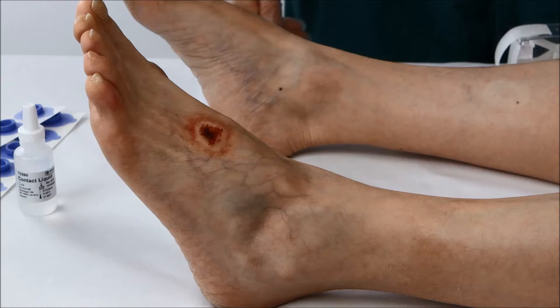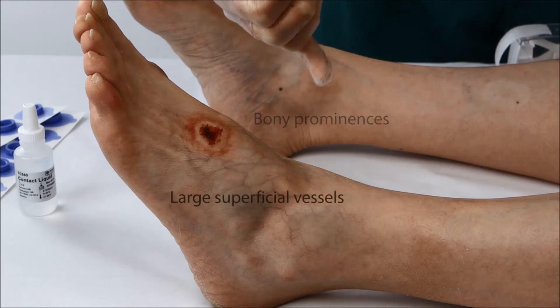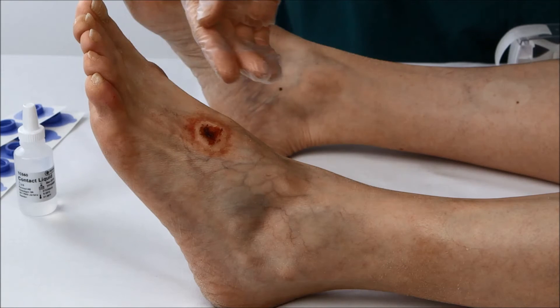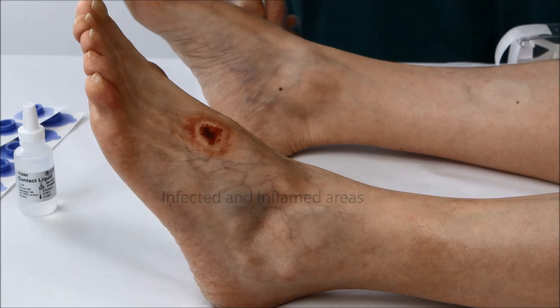When placing electrodes, try to avoid bony prominences, large superficial vessels, calloused skin, the plantar surface of the foot, and infected or inflamed areas close to the wound. Also avoid areas of heavy edema.